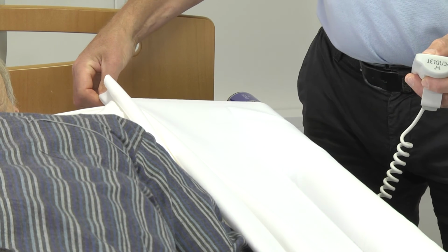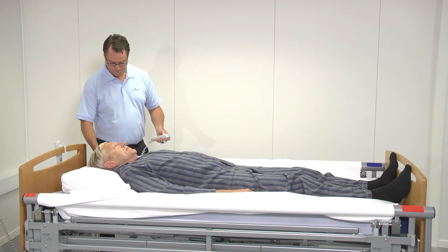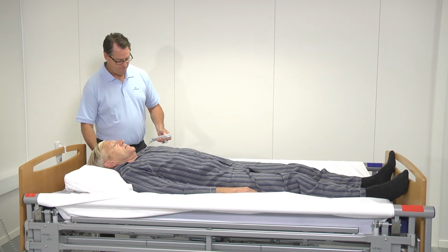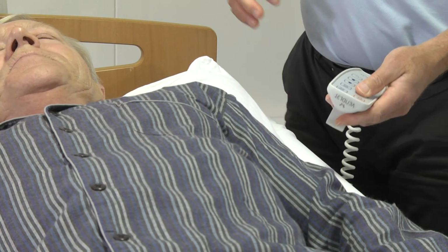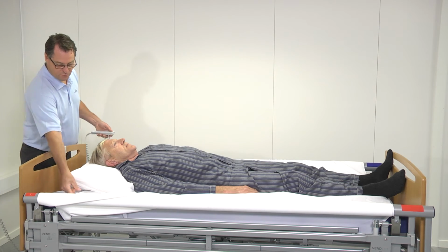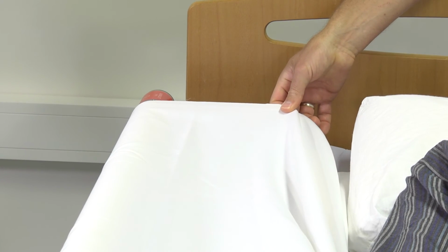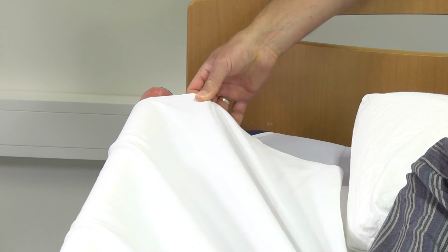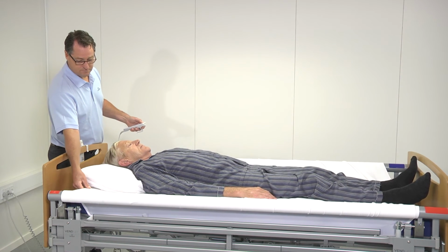Lightly grasp the sheet and guide it towards the head end, while the turning sheet is wound onto the blue bar. Stop when the client reaches the edge next to the blue bar and slacken the sheet on the red side. Lightly grasp the sheet and guide it towards the head end, while the turning sheet is wound onto the red bar. Stop when the client reaches the edge next to the red bar.